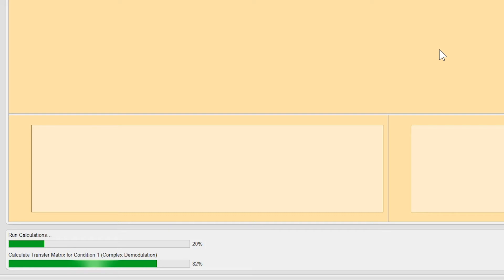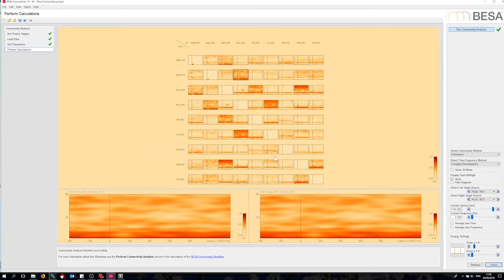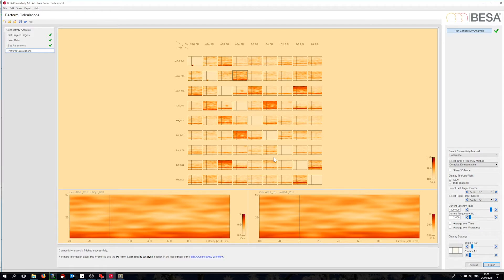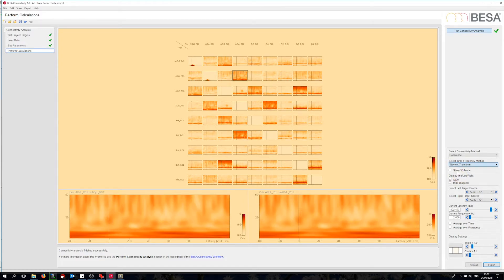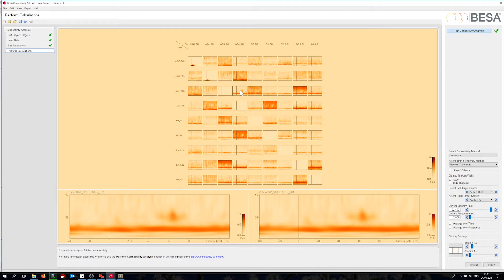Now the program goes through the different methods for connectivity and repeats this for each time frequency method. That will take some time to compute, but since we have an optimization for multi-core processing, it finishes quite quickly. After it finishes, we can see a matrix plot of all channel-by-channel connectivities, showing first of all the coherence plot since this was the first method I selected. Let me switch to the Morlet wavelets and select the channel pair with the most significant coherence outside the alpha band, which is between the two auditory channels where the oscillatory activity was simulated. I can click onto the highest activity and switch to 3D mode to see the connectivities in 3D.